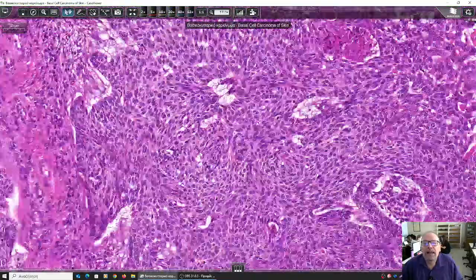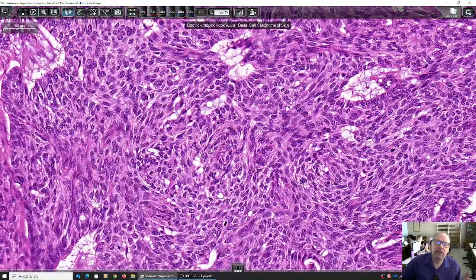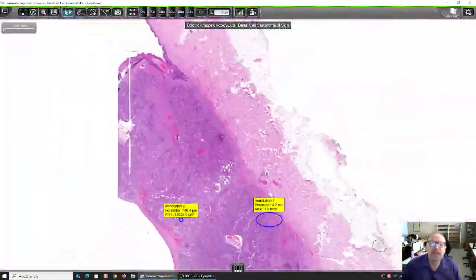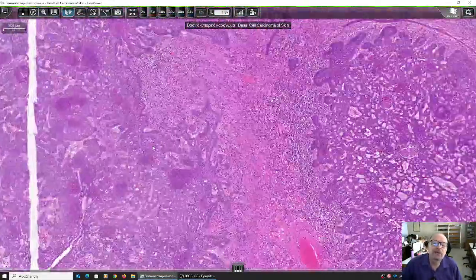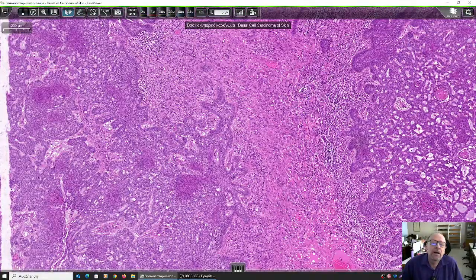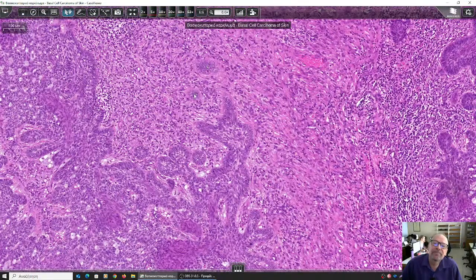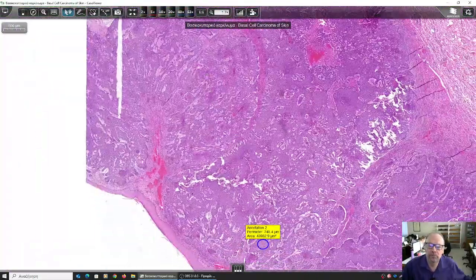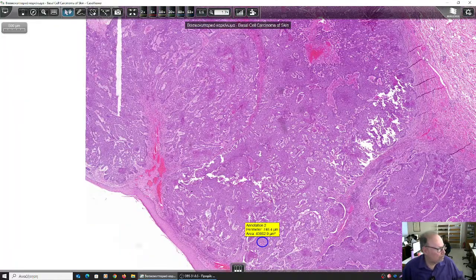Of course, the cells have some degree of pleomorphism. They are all spindle cells, basal cells. They have increased mitotic activity. So you see here all these cells. This could be invasive. You see it grows downwards, even though the whole skin is elevated due to the neoplasm formation.